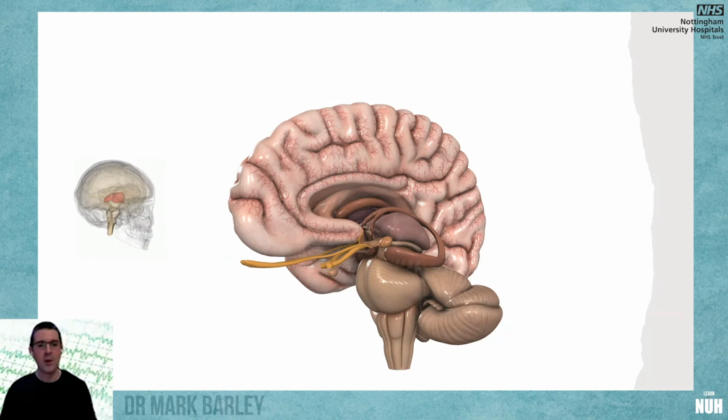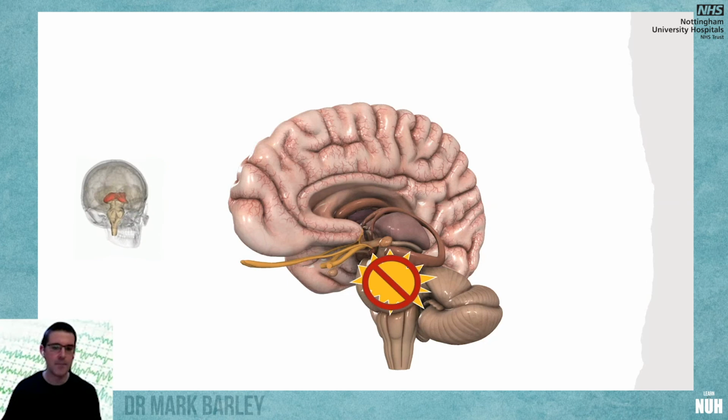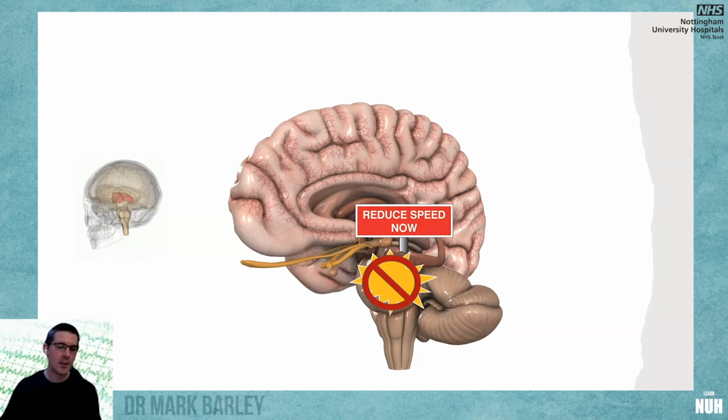So first thing that happens is we blast the arousal centers in the brainstem, bosh. Then we're going to slow down the thalamic firing rate. Normally the thalamus oscillates at 30 to 50 hertz, the gamma band. But with propofol, we slow this down, and the halogenated ethers as well. We slow it down to around about 10 hertz. And that 10 hertz thing is really important. If you remember nothing else, remember 10 hertz.